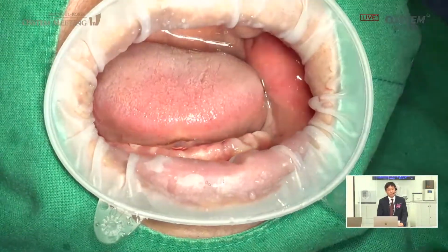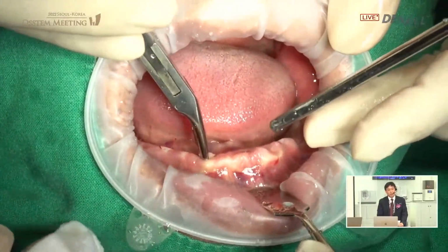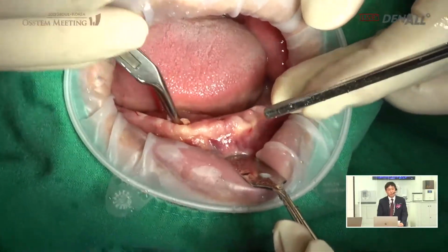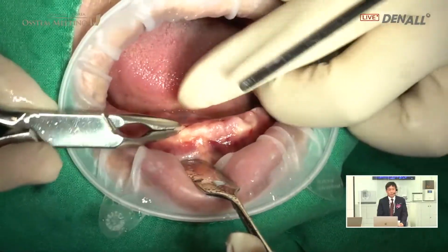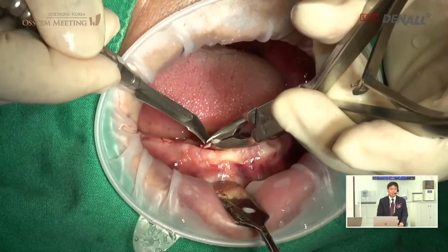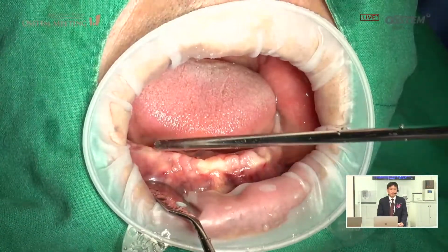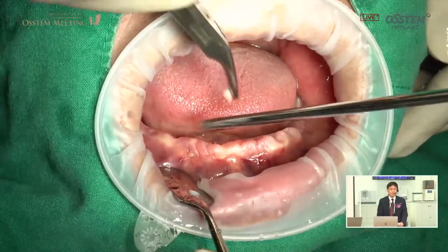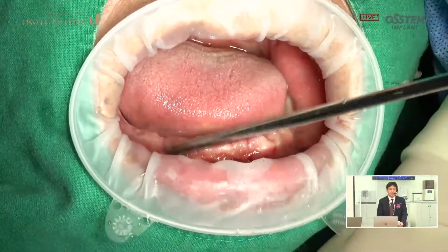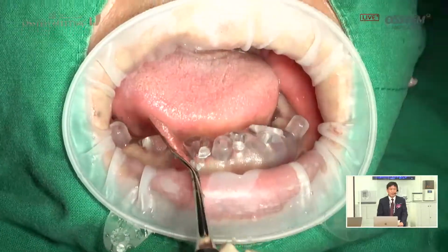As Dr. Park has mentioned, in order to fixate the implanted template, the tissue punch is made to find the position and the gingiva is being removed. If it is in between mucosa, you don't need to pull with strength, you just need to use the blade to remove it. Tissue has all been removed. Guide will be adapted.